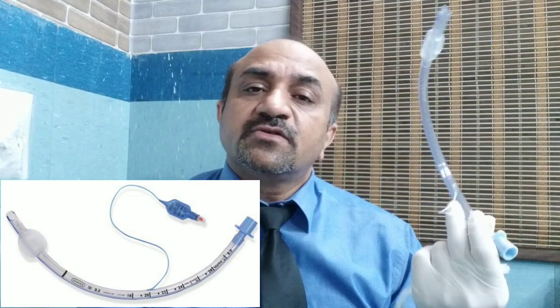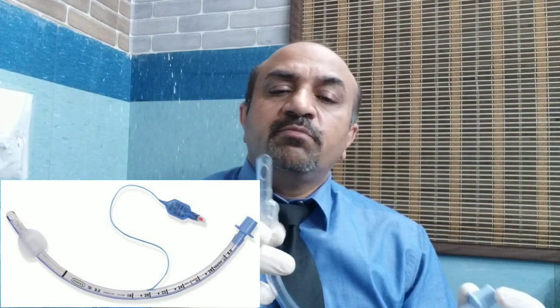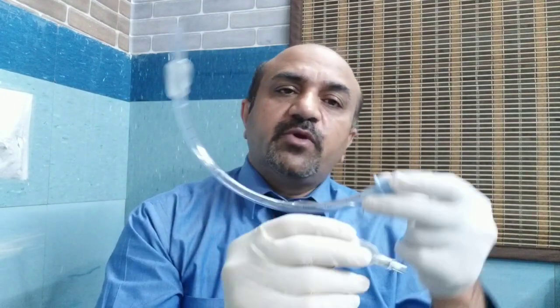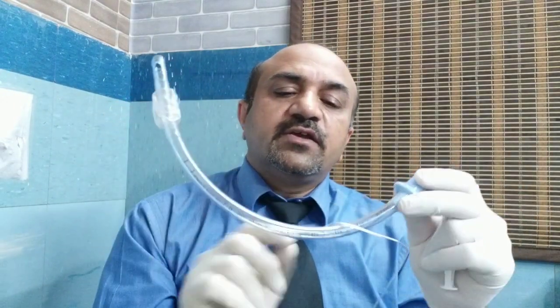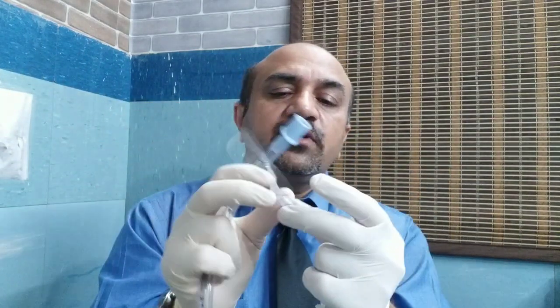One is this one. This is known as the endotracheal tube. Now this endotracheal tube has some parts. For example, this one is the balloon of the endotracheal tube. This one is the balloon, and there is a line or pipe coming all the way up to here, and then it comes out. And here we have the pilot balloon.